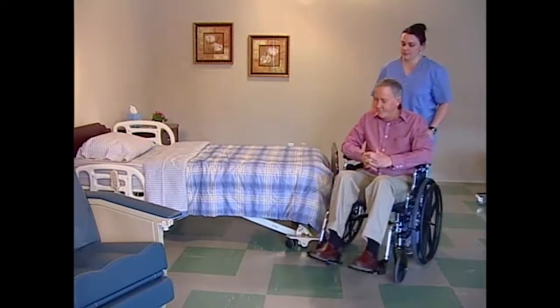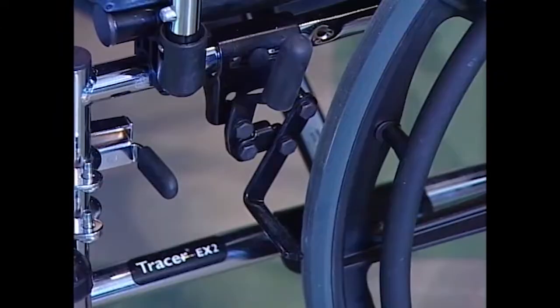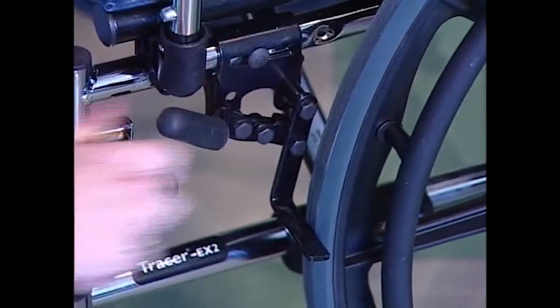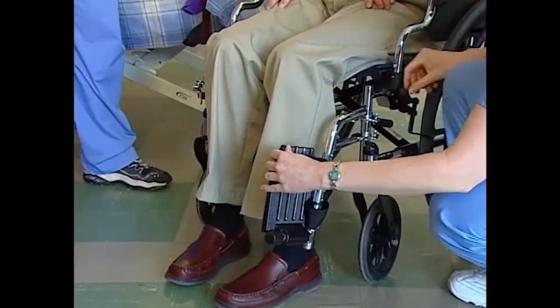Begin by positioning the two chairs as close to one another as possible. Lock the rear casters on the recliner. Lock the wheel locks on the wheelchair. Move the front riggings out of the way.